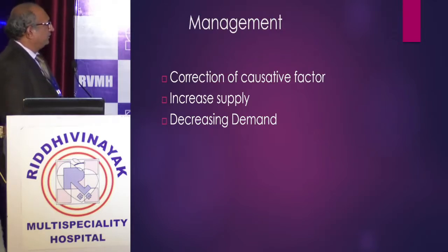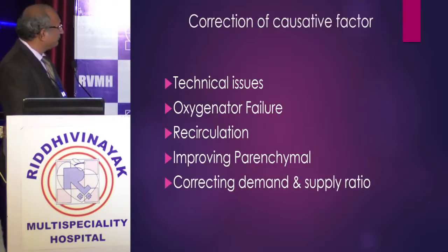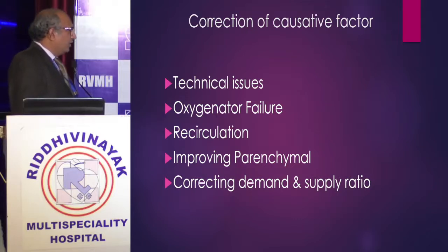So management: correction of causative factors, increase supply, or decrease the demand so that you can maintain the saturation. So correction of causative factors: technical issues, oxygenator failure, recirculation, improving the parenchyma, and correcting the demand and supply ratio.